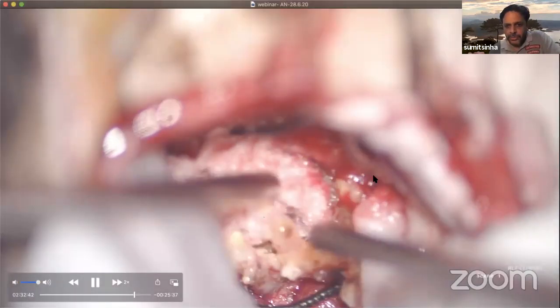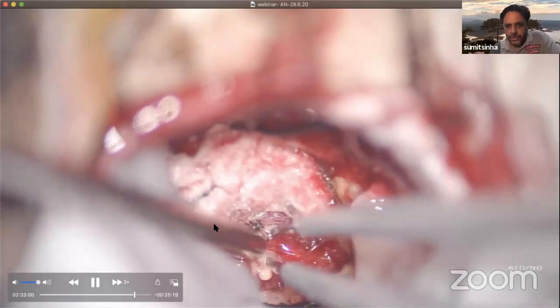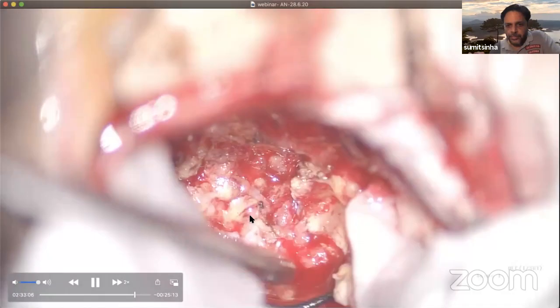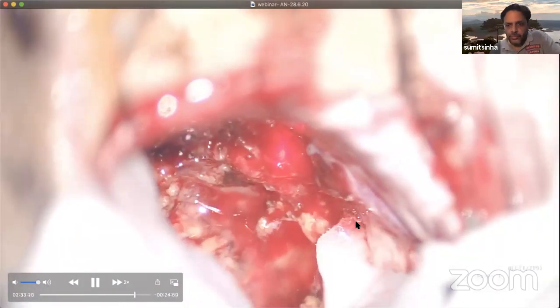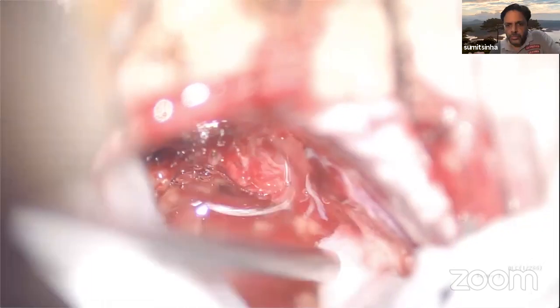So, last stages of the tumor removal. And some more last bits of the tumor capsule being removed. And then soon I will come back again to the facial nerve. Water dissection.